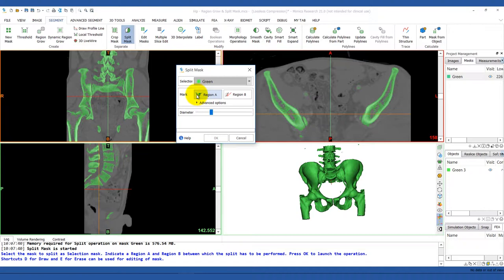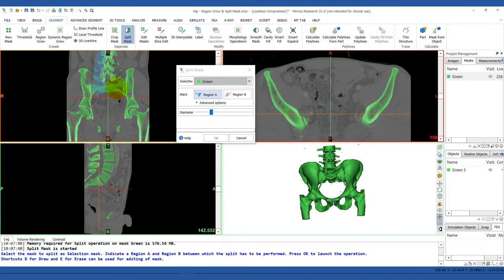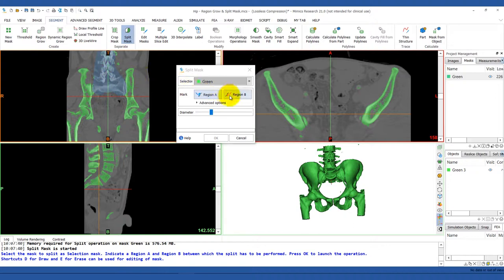First, mark the sacrum as region A, and then the rest as region B.